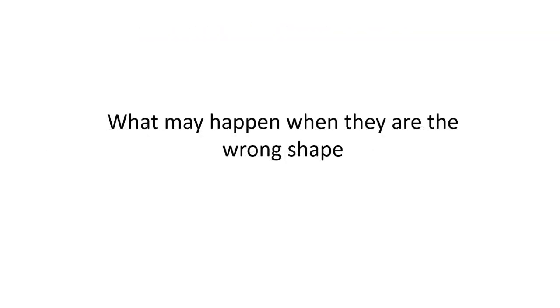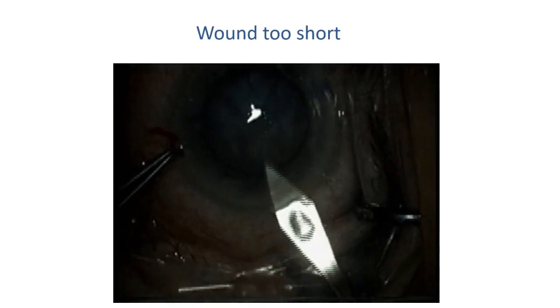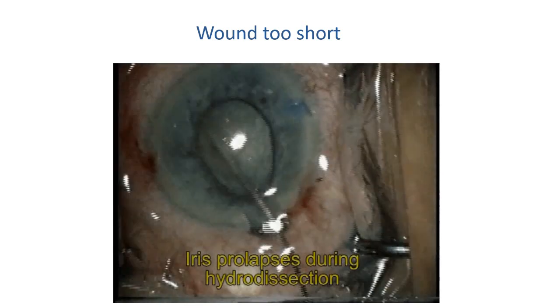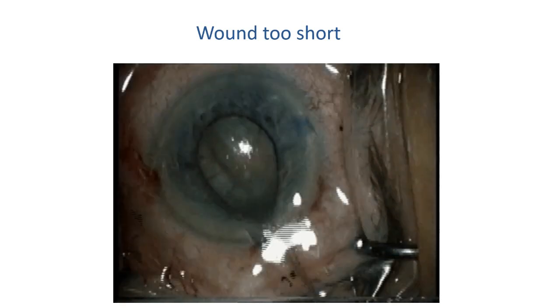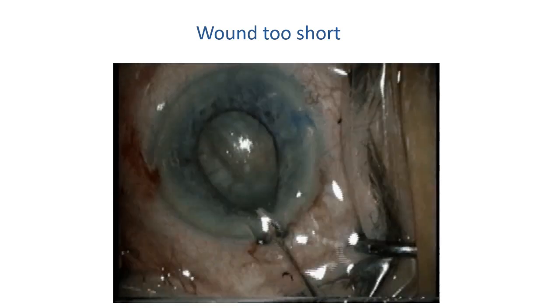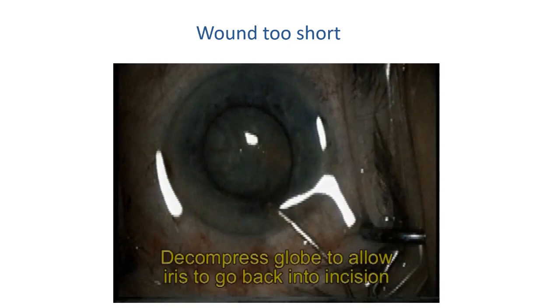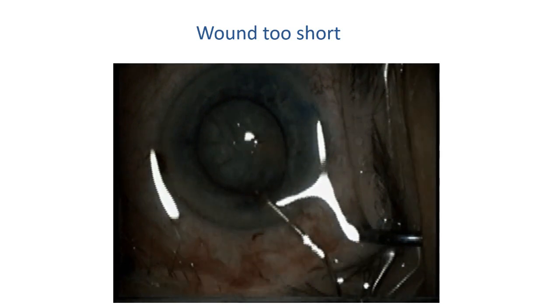So what may happen when wounds are the wrong shape? First of all, we have a wound that was too short. This is one of my trainees operating. You'll see what happens when she does the hydrodissection. The iris prolapse is out. We now need to try and get it back in, and that means that you need to decompress the wound and not inject more viscoelastic. I opted to take over at this point. We closed the wound and I moved superiorly to deal with this dense cataract.